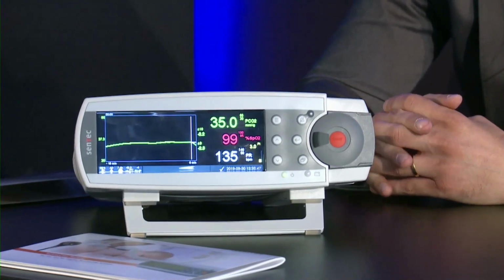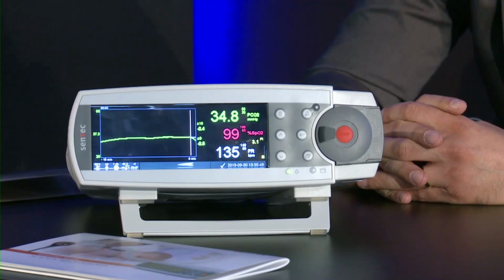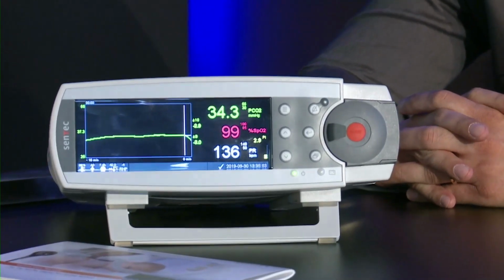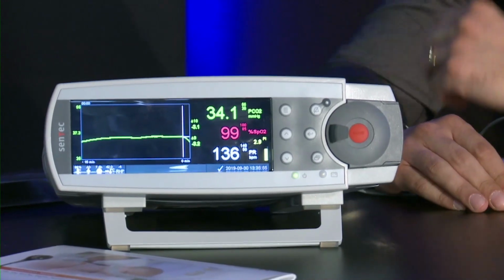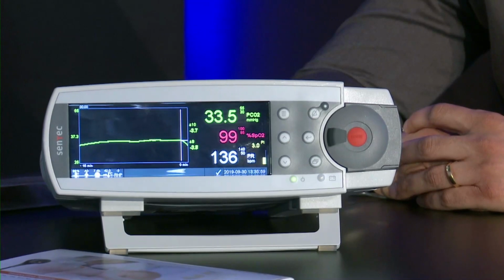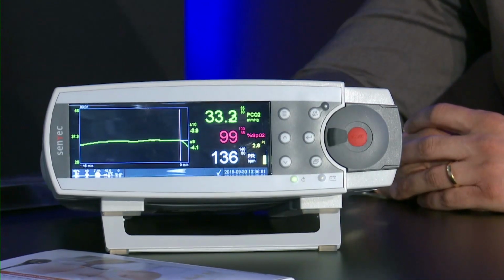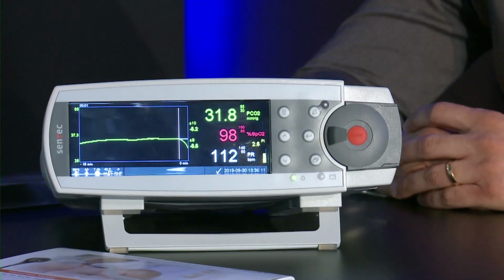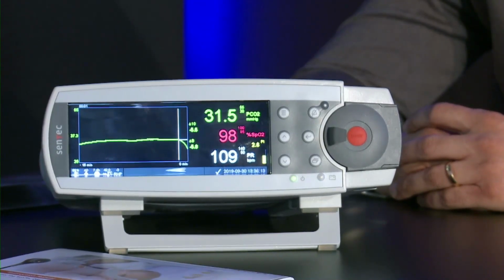So, Sorin, I think you can stop hyperventilating. We can already see on the monitor there was a really nice drop of the CO2, and it still continues. There is a small time delay, and then we have a number displayed here. This is called the delta 10. The delta 10 gives you the change of CO2 within the last 10 minutes. It's also a helpful tool to see what happened with my patient.